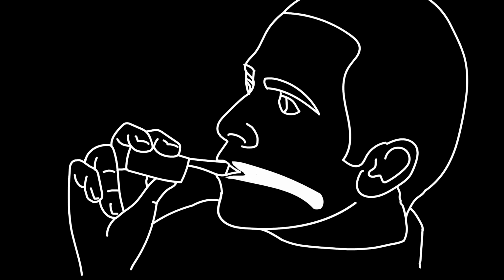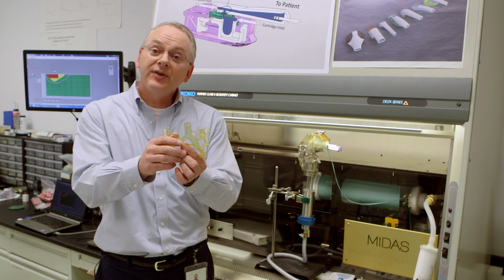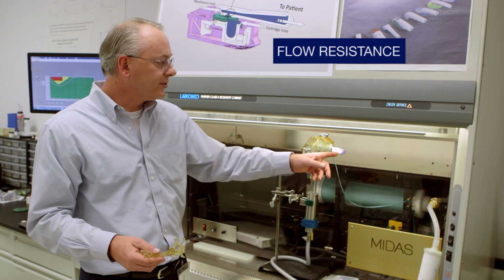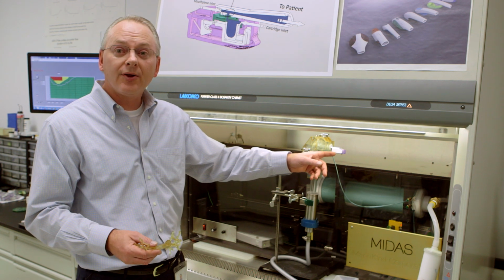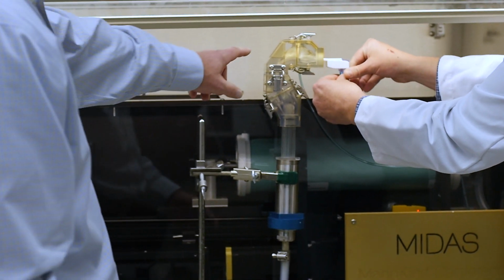And that's because we're trying to get this powder deep into the peripheral aspects of the lung. And the way that we get the powder into the lung is by moving it slowly. By slowing it down, we're better able to navigate all of these pathways, all of these twists and turns. And we slow it down in a real simple way. We use a real simple concept called flow resistance that's embedded inside the inhaler. The inhaler is just a large resistive element. We'll run one more cycle.